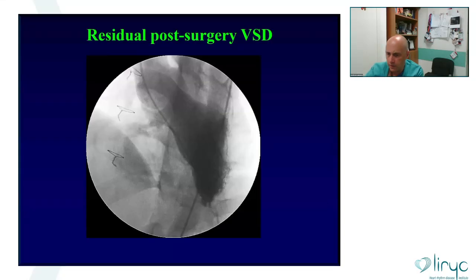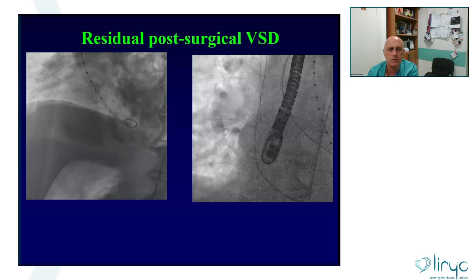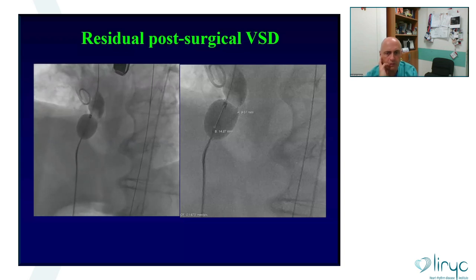Some few slides, if I'm not too late for you, about residual post-surgical VSD. I heard that Mark already told about this special subset of patients where it is really difficult to understand where the defect or the defects are and what the size is. I do like again to help myself with balloons, so that gives me also the waist where I think it will be the landing zone for the device.